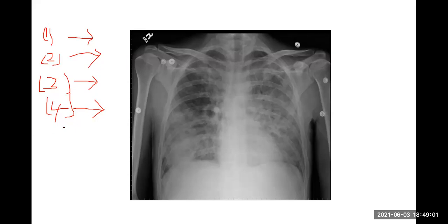Now, number 5, diffuse alveolar hemorrhage. Pulmonary hemorrhage කියන්නේ ඕක එනවා අපිට මේ අපේ ඔගොල්ලෝගේ level එකට යනවනේ leptospirosis. There are lots of other causes of pulmonary hemorrhage, Goodpasture syndrome මේක නම් කවදාකවත් දකින්න හම්බෙන දේවල් නෙවෙයි. But we know leptospirosis. So ඒ වගේ ඒවා එන්න පුළුවන්. So there are 5 differential diagnoses. These sort of patchy සුදු everywhere X-ray. Right, patchy sudu everywhere X-ray. These are the differential diagnoses.